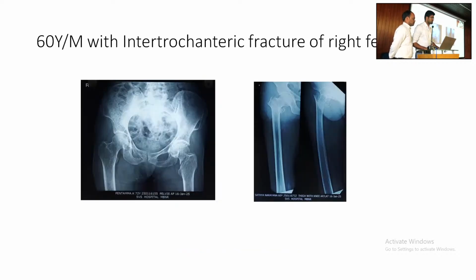Do you know how to choose the diameter of the nail? Yes, sir, 70 to 80% of the medullary canal should be filled, at the isthmus. 80% can be filled. How do you measure the medullary canal?